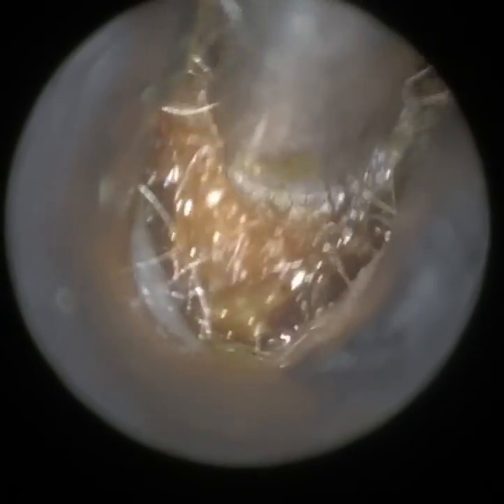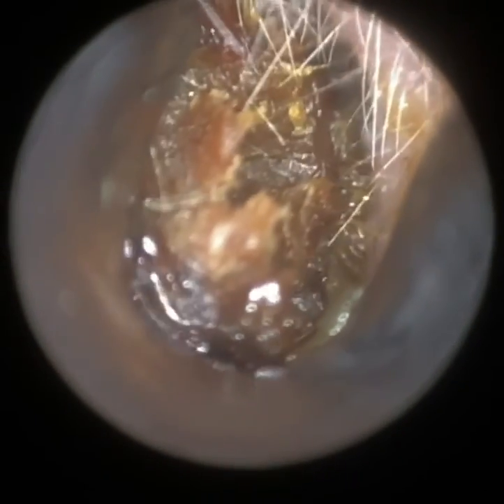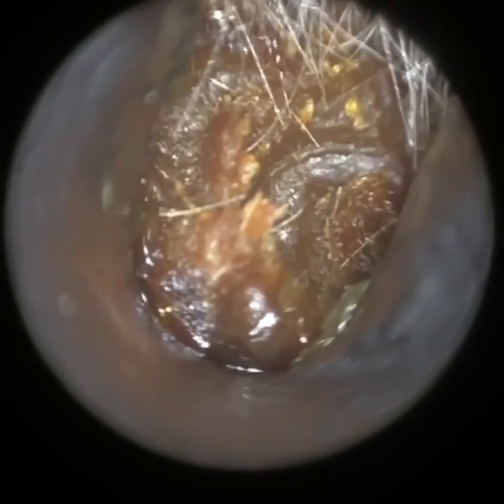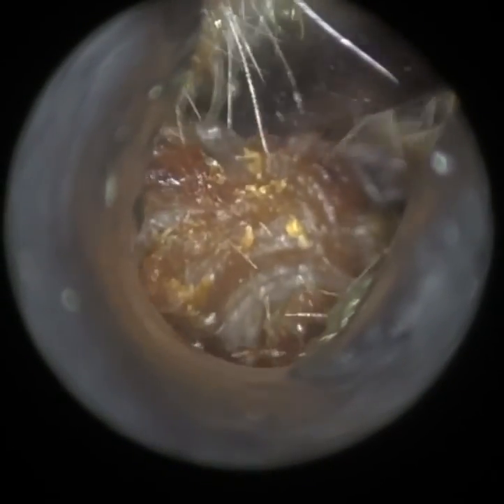We're right near the first bend — you can just see those hairs. I'm going to revert to the ear hook as I can't come away any further with the suction probe. It's literally just visible at the entrance, just past the first bend — you can see those hairs, which are a good indicator of the first bend. So once more I've dilated the entrance of the ear, and I'm going to insert the St. Bart's ear hook, glide it at the roof, turn it clockwise 90 degrees, embed the tip of the hook into the wax plug, and slowly bring it out.